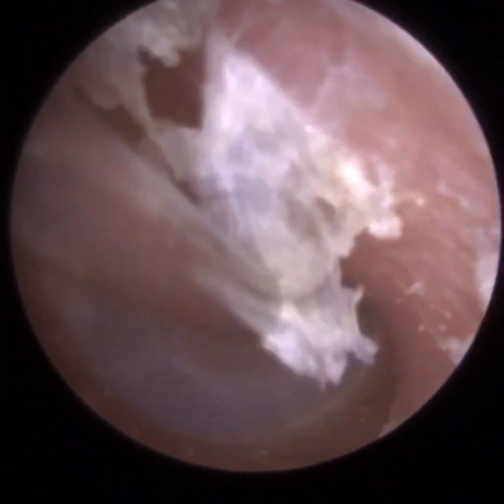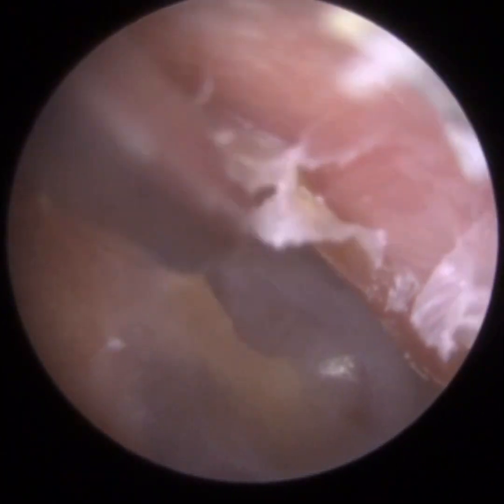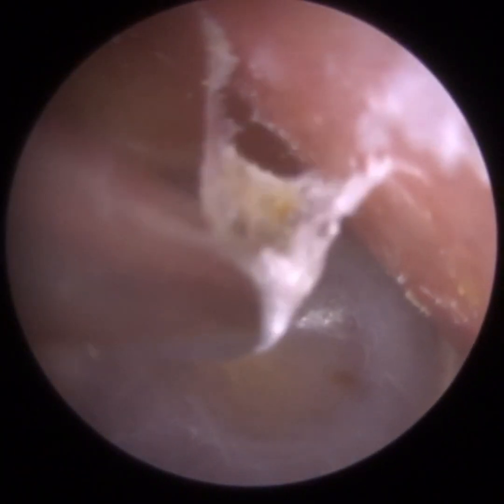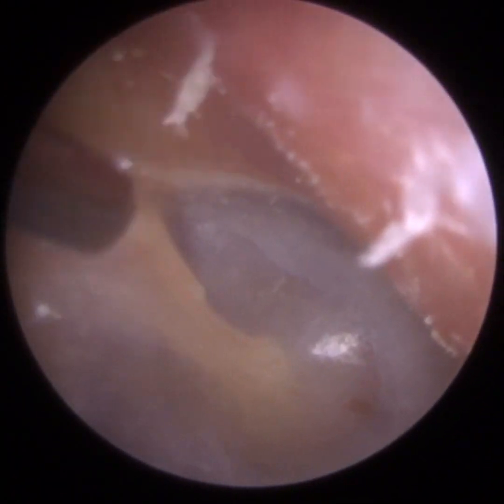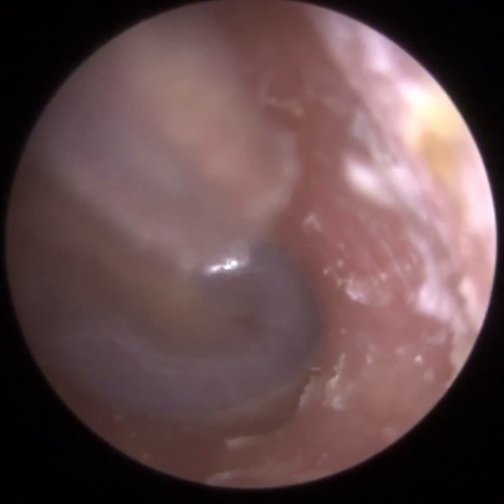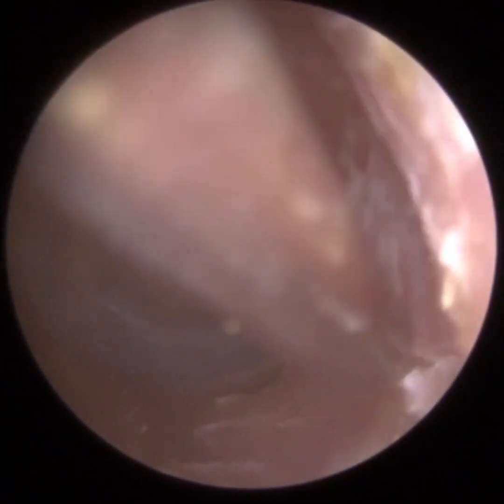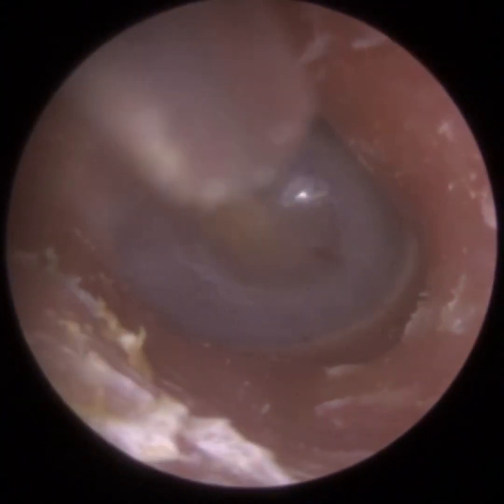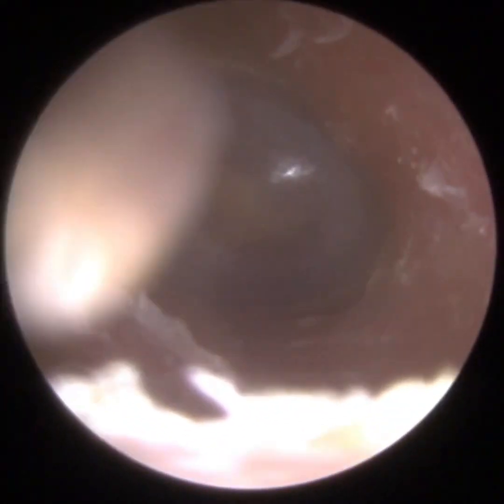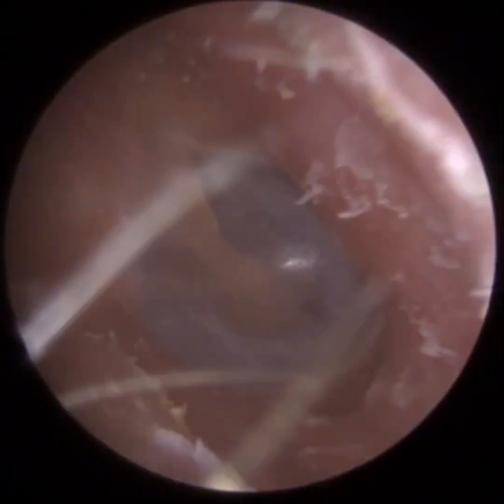You can see how thick the skin is and how strongly adhered it is to the canal wall. This is the anterior canal wall — the front part of the ear canal. Sometimes you just have to be really patient. On the bony part, we really want to avoid making contact with the canal wall. On the outer cartilaginous portion, you can see I was putting a bit of pressure trying to lift the skin off, because the cartilaginous portion is not as sensitive as the bony part of the ear canal — it's a bit more flexible. We also have some fatty tissue there sometimes. The skin that lines the outer third of the ear canal is a lot thicker — about one millimetre in thickness — whereas the skin that lines the inner two thirds is about ten times thinner, at 0.1 millimetres. Therefore it provides less of a buffer to the bony part of the ear canal. So there's the patient's eardrum.